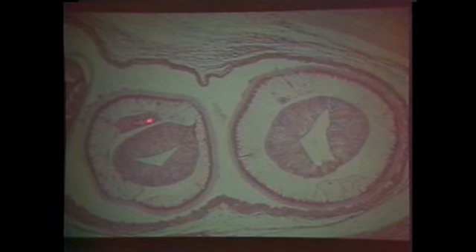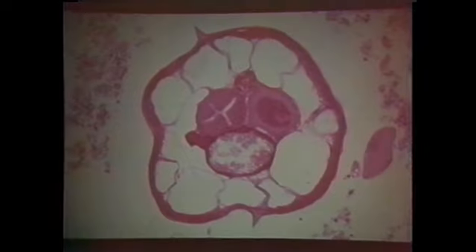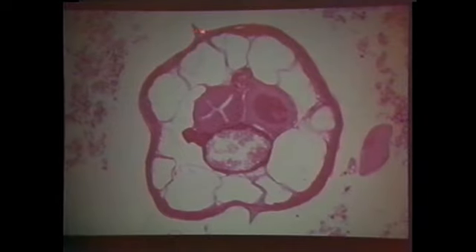Now, I could sit here right now and tell you about the beautiful structures that we're seeing here, but I want you to focus only on the thing that we're talking about. Okay? All right, thick cuticle. Do you see a cuticle? No. All right? Thin. Here we go. Here are those lateral alae. They're pulled out. And you people now are trying to diagnose it by the genus. You're telling your friend, this is Enterobius. You're trying to look good in your friend's eyes. Good. Okay, anyway, the cuticle can be different colors if you do different stains.